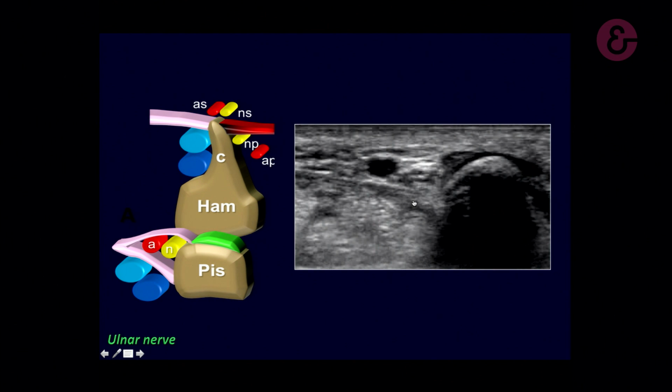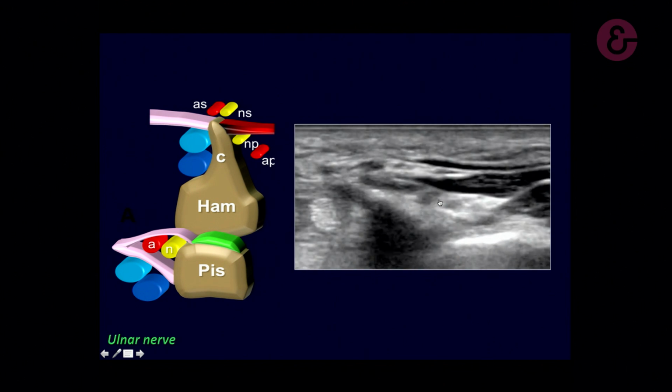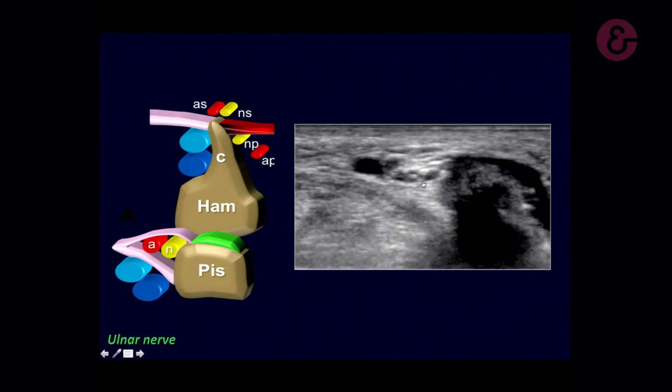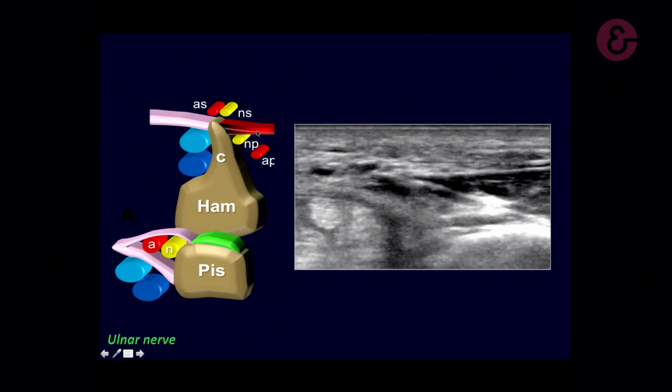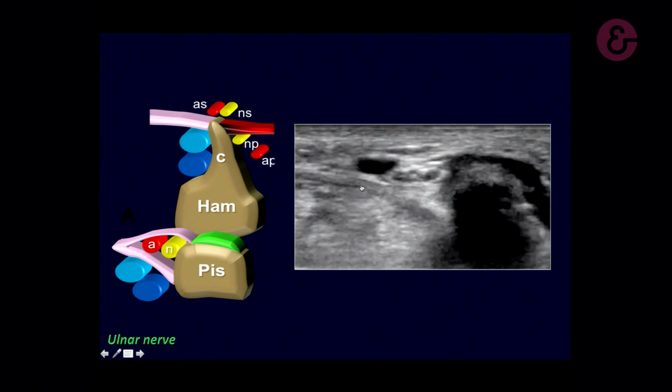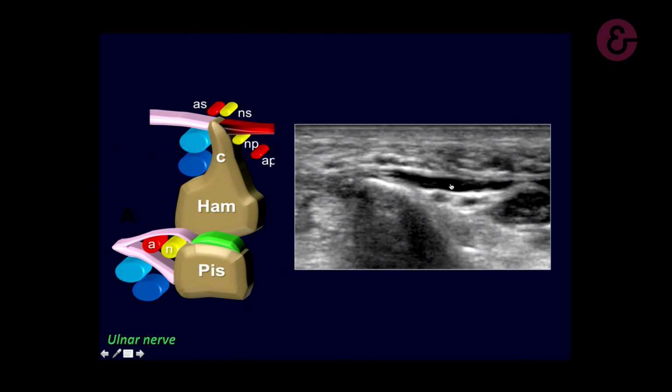So we will move a little bit. We start looking at the nerve first, not the artery, the nerve. I move distally from here to this level. And you can see this is the deep branch. You must focus just on this one. This is the deep branch, and it is located below the muscle and close with the artery, the nerve and the artery over there. It's always the same. Maybe a little bit superficial, maybe a little bit deep, but it's always the same.